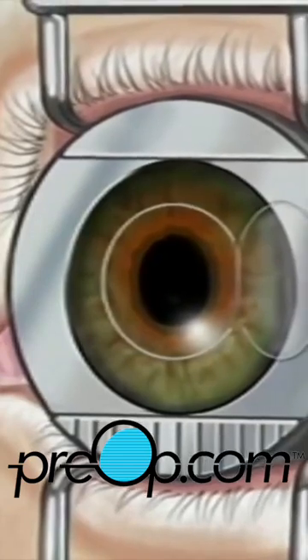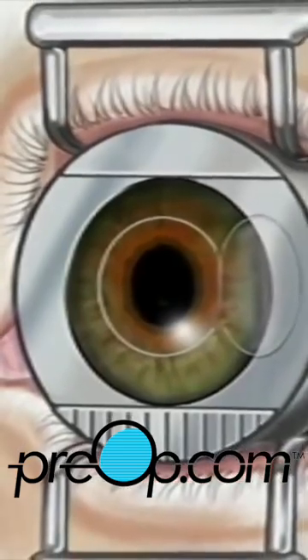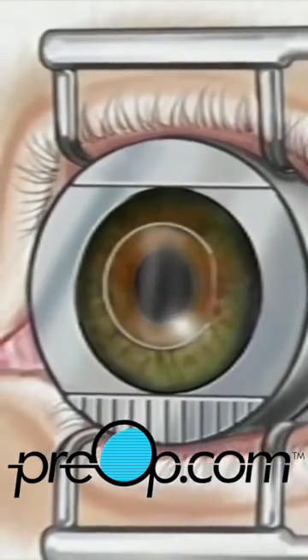The entire procedure usually takes about 5 minutes and is painless. The corneal flap is then closed and the surface is rinsed.